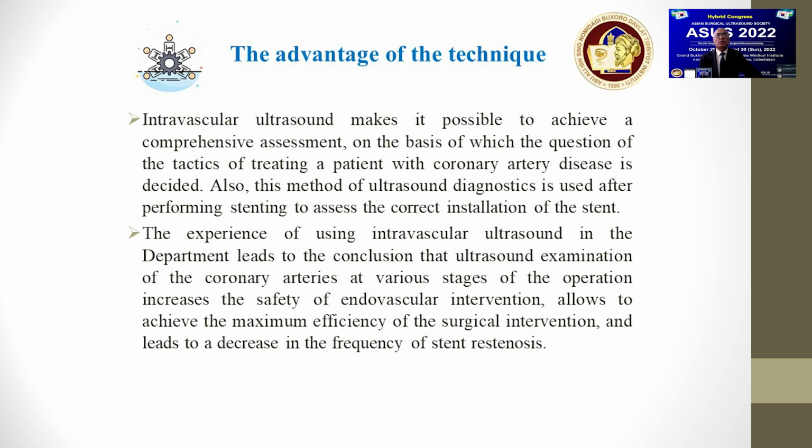The advantages of the technique. Intravascular ultrasound makes it possible to achieve a comprehensive assessment on the basis of which the question of the tactics of treating a patient with coronary artery disease is decided. Also, this method of ultrasound diagnostics is used after performing stenting to assess the correct installation of the stent.